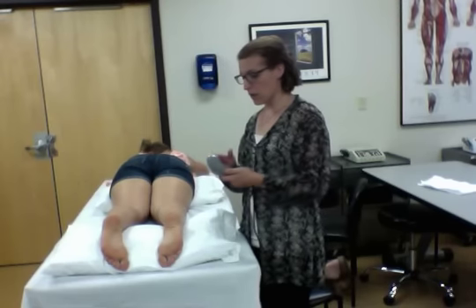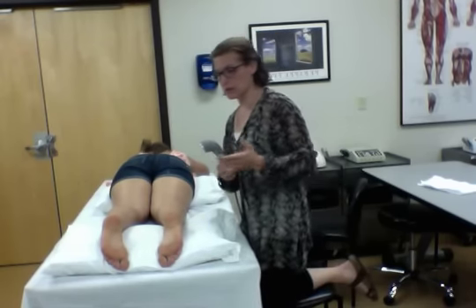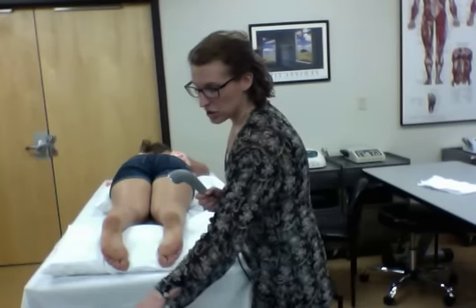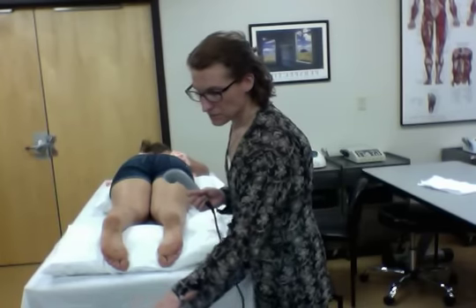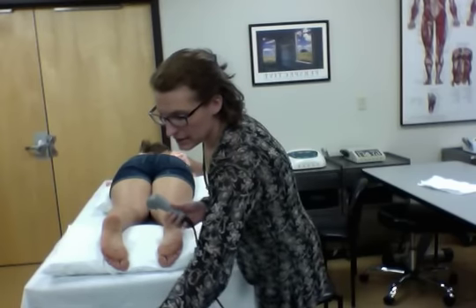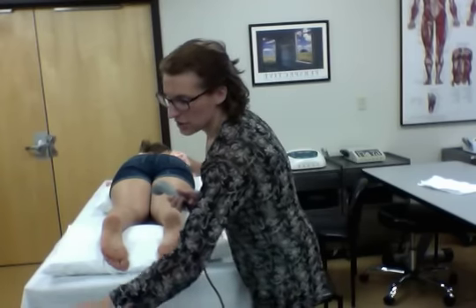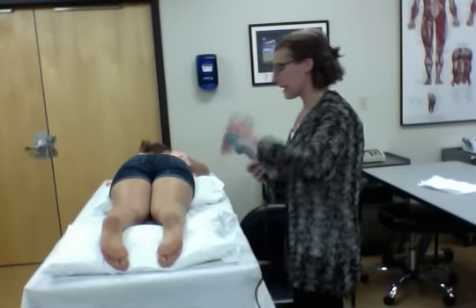If the area is more than twice the size of the ultrasound head, you might need to do 2 separate treatments. I'm going to go ahead and set my machine for 1 megahertz for a 20% duty cycle at an intensity of 1 watt per centimeter squared. And I'm going to change it to a 10-minute total treatment time.